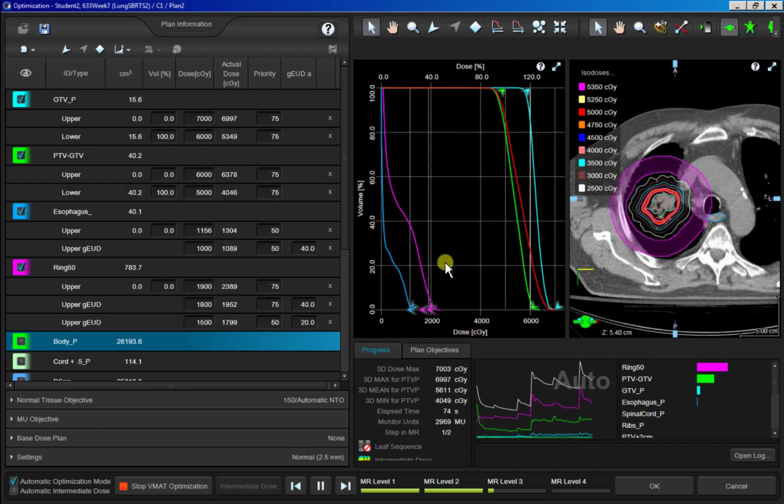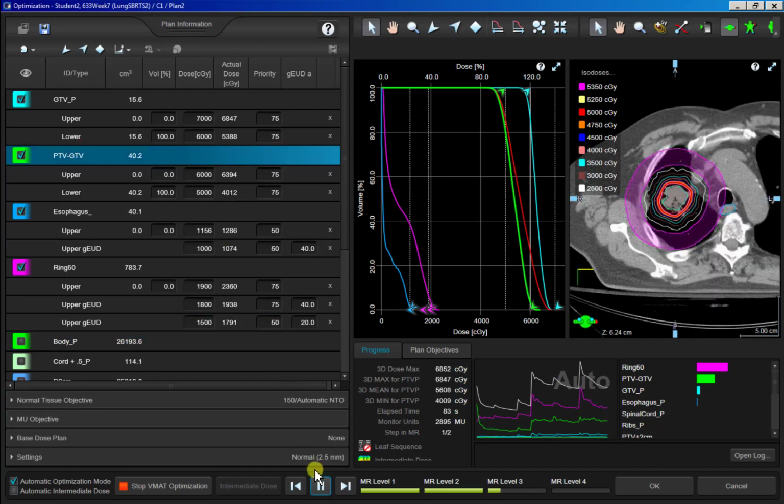If we were overlapping with OARs or very close to OARs and I was worried about meeting those constraints, then I would do my standard extra lower objective, 97%, something like that, slightly over prescription dose to get that coverage so that I didn't have to normalize down lower and possibly cause my OARs to go above their objectives.